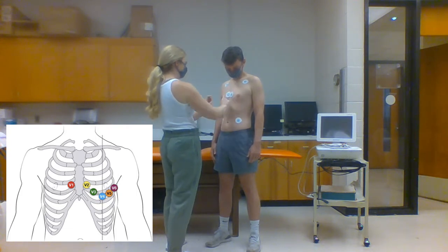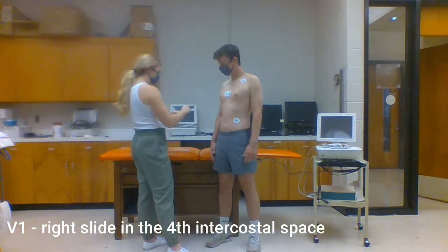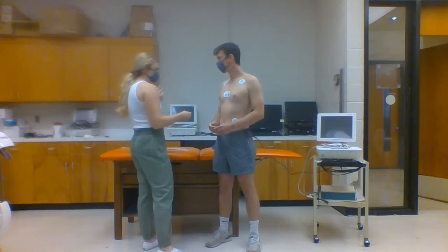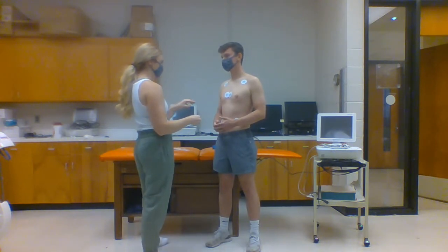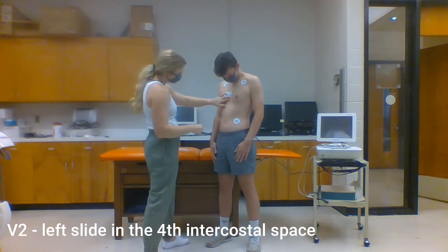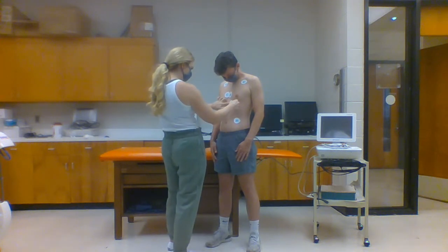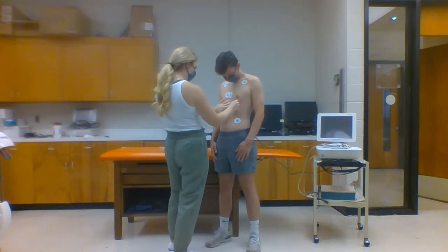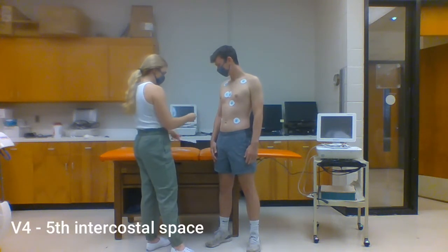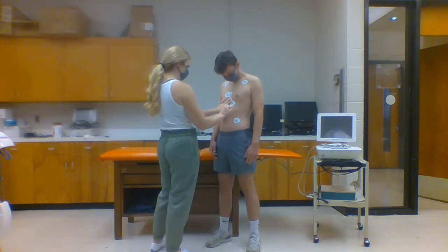The 6 chest leads are V1, where the electrode is placed close to, but not on the sternum, on the right side of the sternal border, placed in the 4th intercostal space. Next, V2 is placed directly across from V1, again, placed close to, but not on the sternum, on the left side of the sternal border. This is also placed in the 4th intercostal space. We then skip V3 and move directly to V4. This electrode is placed in the midclavicular line in the 5th intercostal space.